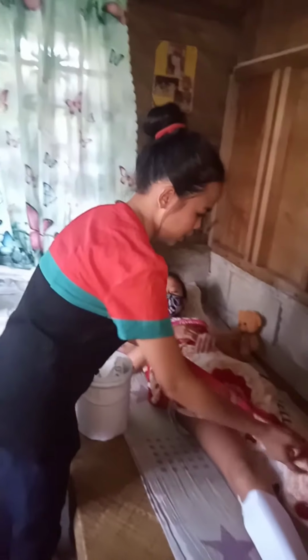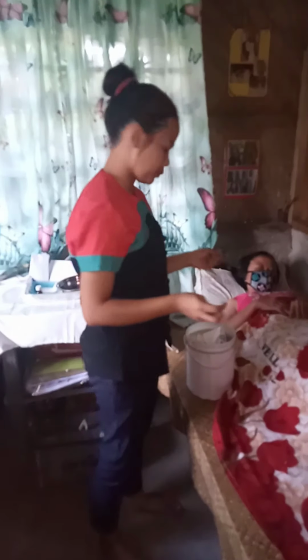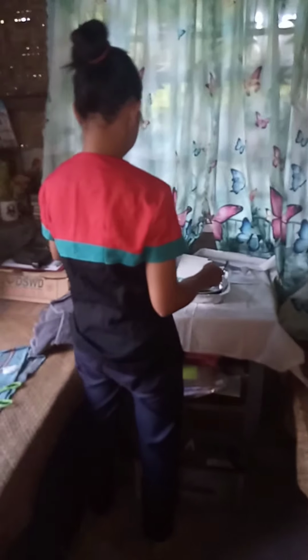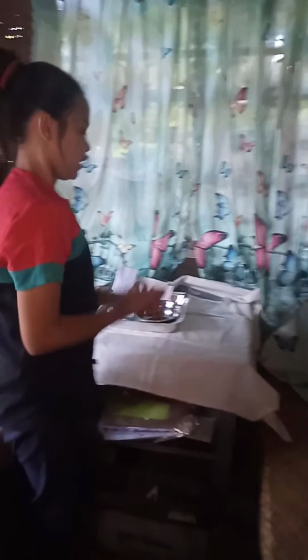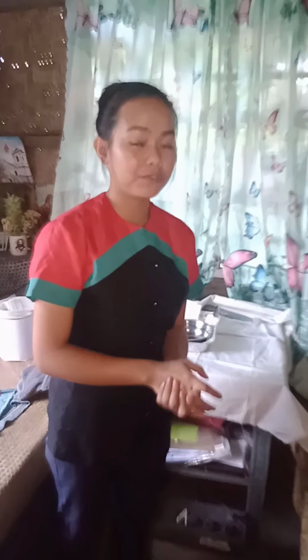Then it is the time to position your patient in a comfortable position. Then dispose of all your supplies. That's all for the dry dressing.